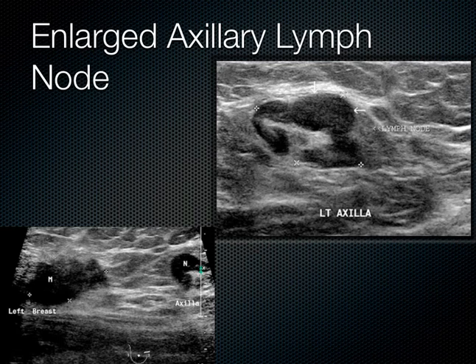This ultrasound image shows the left axilla in a patient who has a hypoechoic group of lymph nodes, and the metastasis is seen here. We can see this lymph node involvement along here, so when you get metastases to the lymph nodes, you look up in the axilla. This is the kind of thing you can see: a very abnormally shaped lymph node with lobules to it. I would generally say a very enlarged lymph node. And the same thing's going on over here.